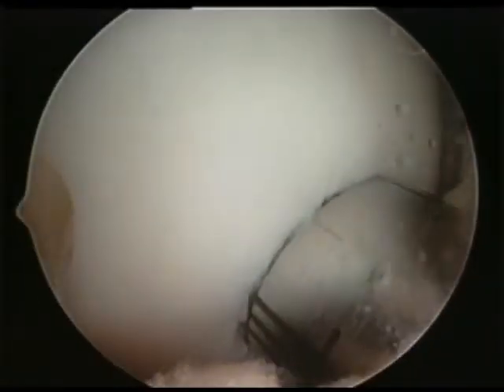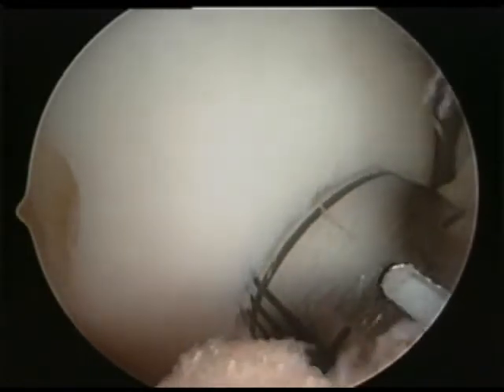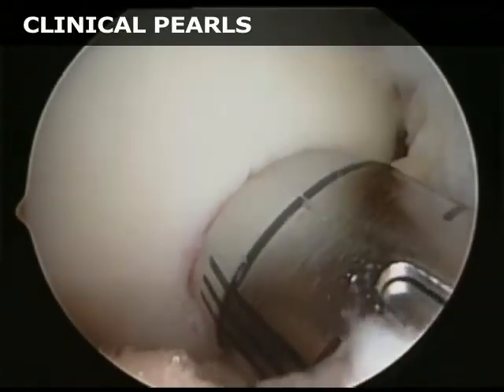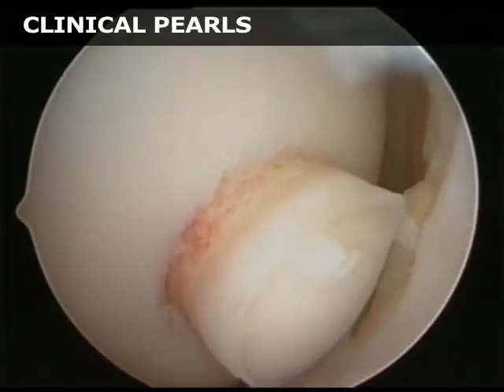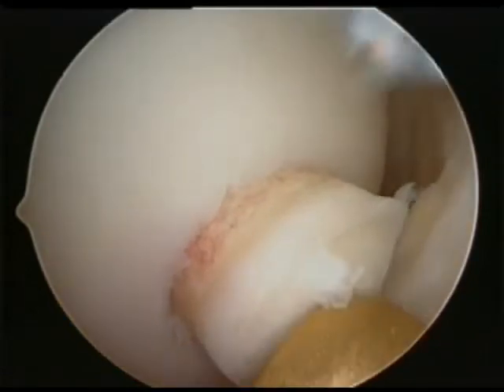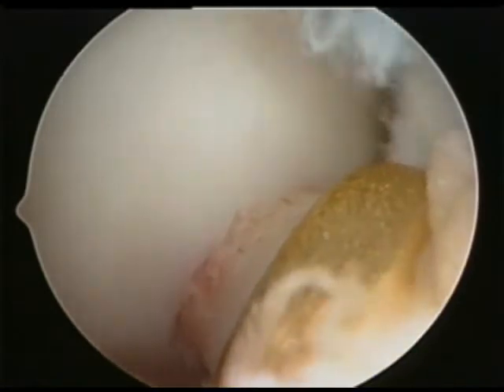Introduce the plug that was harvested from the superolateral trochlea just proximal to the sulcus terminalis through the harvesting tube through the inferomedial portal. The use of satellite portals is often necessary for correct trajectory of plug placement. However, in this instance, the inferomedial portal had correct trajectory to introduce the plug. When the tube is fully seated, the bone core should remain slightly proud.